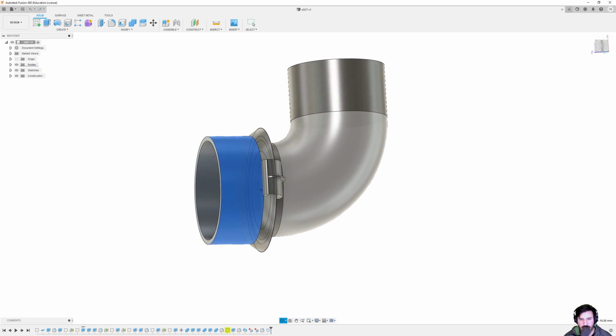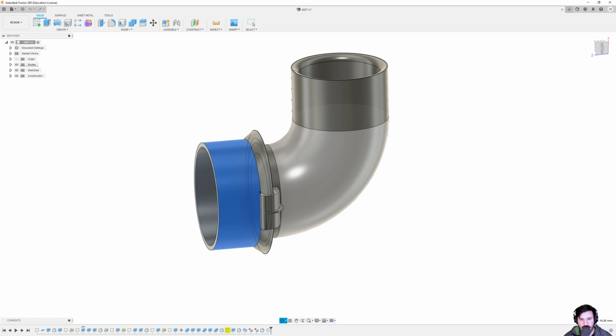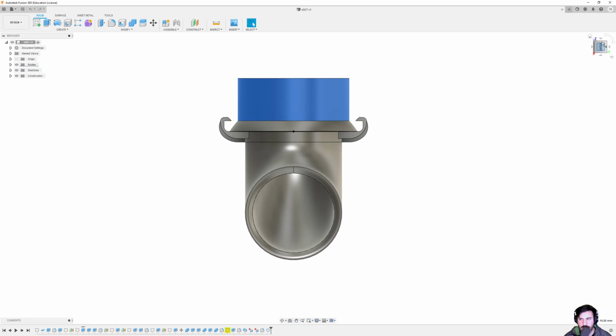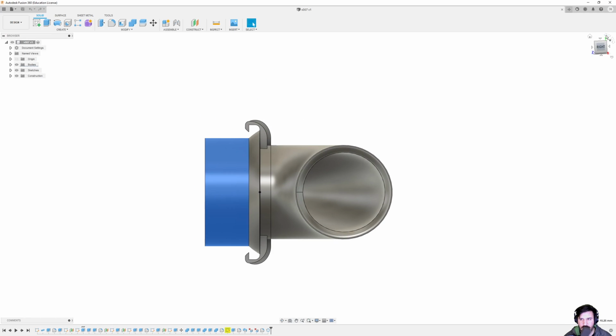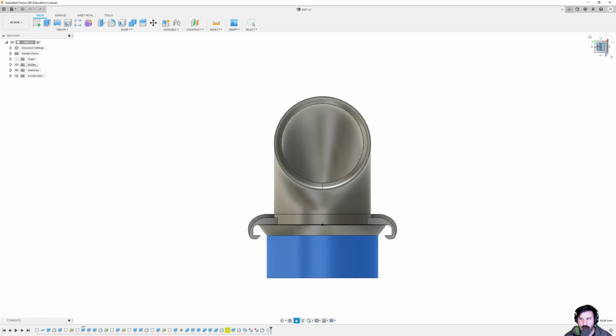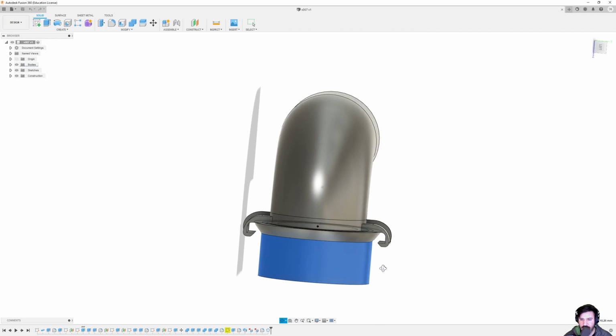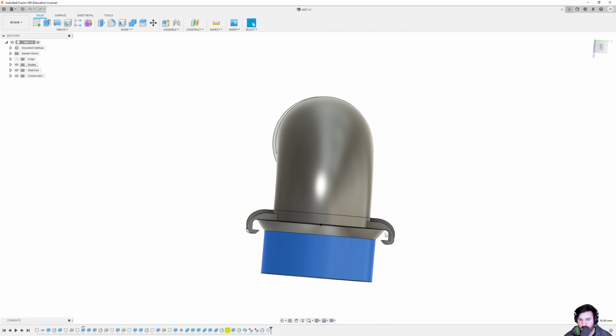And the secondary reason why is I was printing it in this orientation here. So I was printing it like this, where I had some supports here, some supports here directly trying to support this. I specifically did not put supports in here. All these angles should be good enough to do it without supports. If this bottom is supported here, which I had underneath, so I didn't have to carve out any area underneath and clean it out and all that.